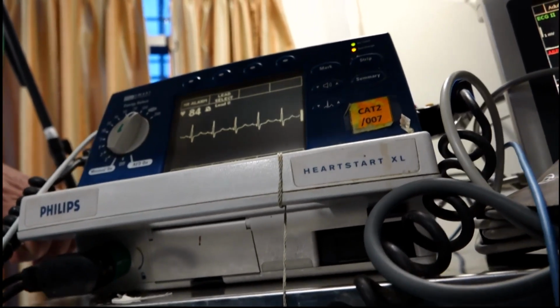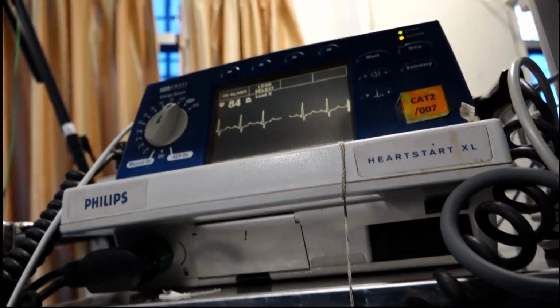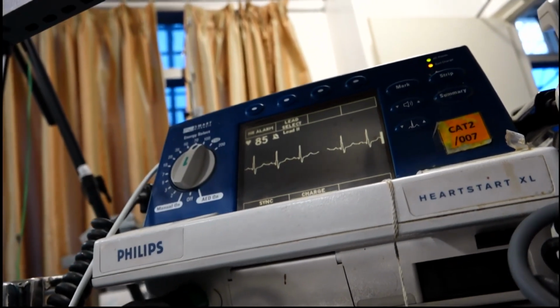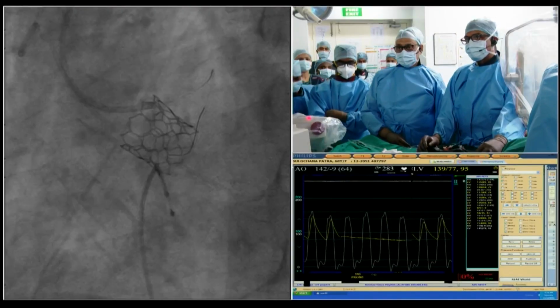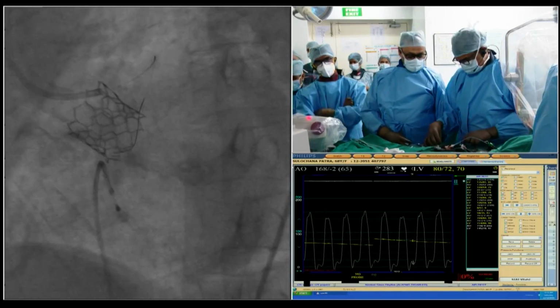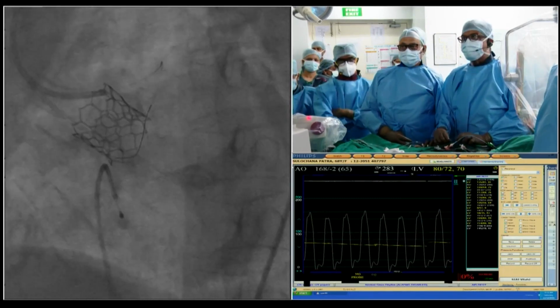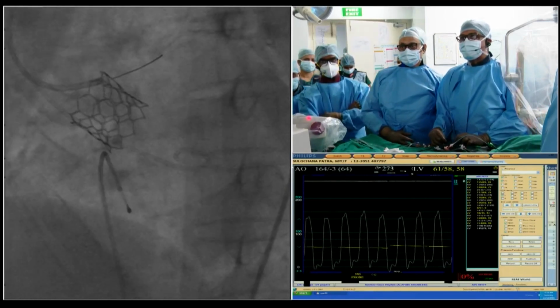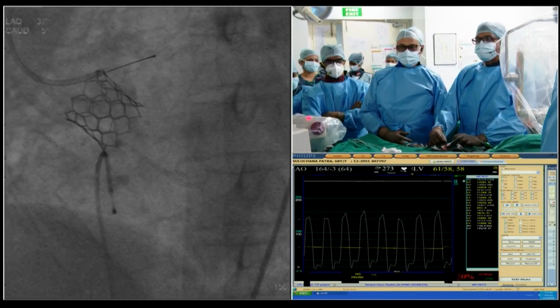Because the hard portion may also be keeping the leaflet a little away. Dr. Clare has suggested you could pull the wire back and see if the leaflet obstructs. But I think if you can just repeat one injection in a caudocranial view, it'll probably make things very clear.